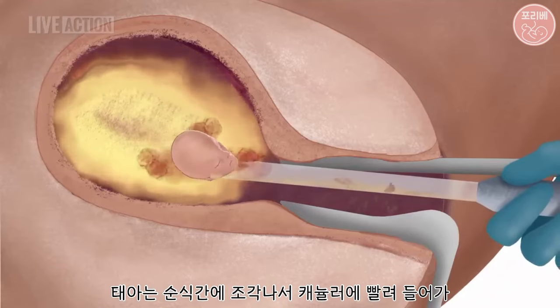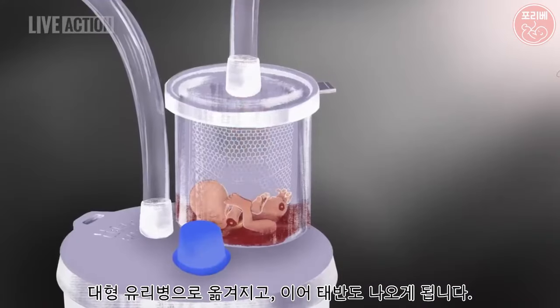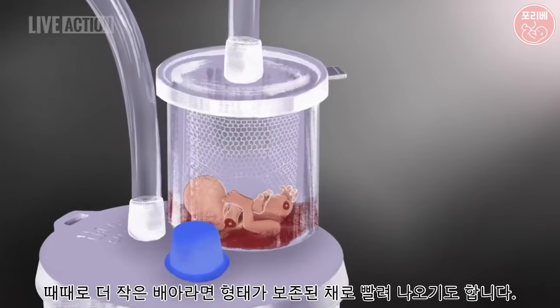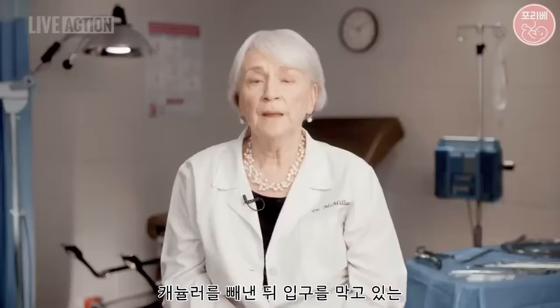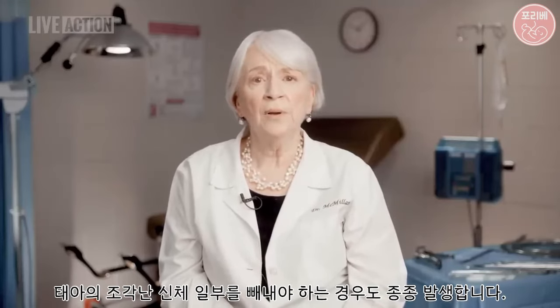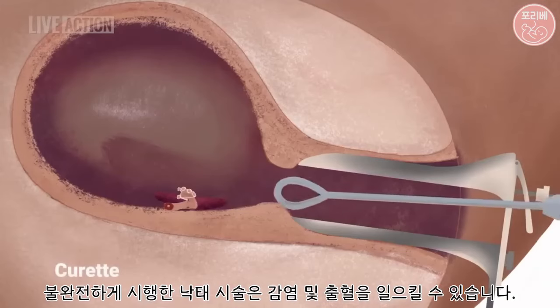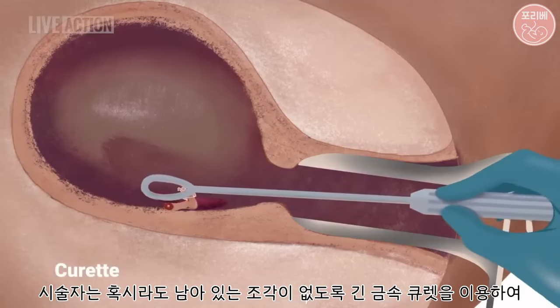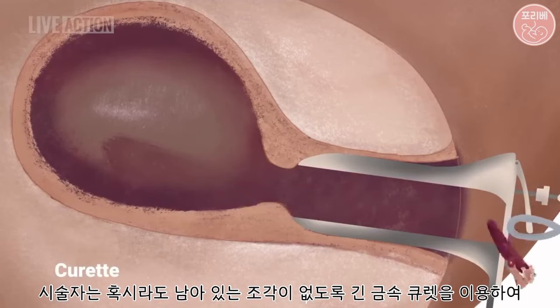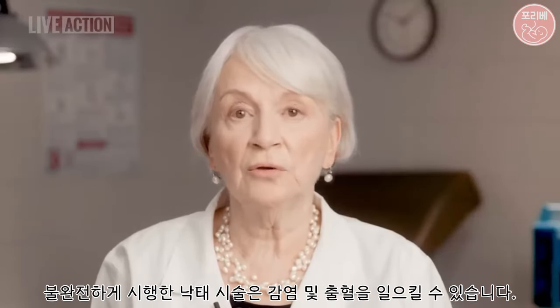The fetus is rapidly torn to pieces as it is pulled through the cannula and tubing into a large glass bottle, followed by the placenta. Sometimes smaller embryos are pulled through intact. Occasionally, the abortionist must remove the cannula and pull out body parts that have clogged the opening to complete the abortion. Once the abortionist thinks everything has been removed, she will sometimes use a long metal curette to scrape the lining of the uterus to make sure no parts are left behind. An incomplete abortion can cause infection or bleeding.